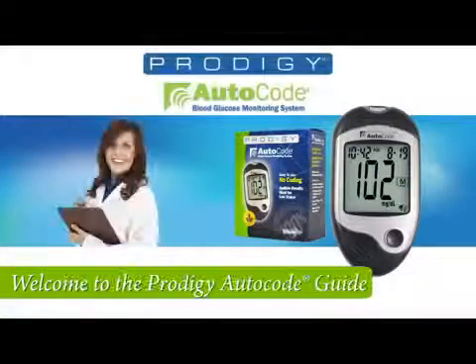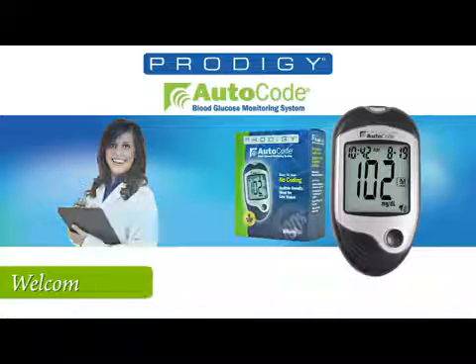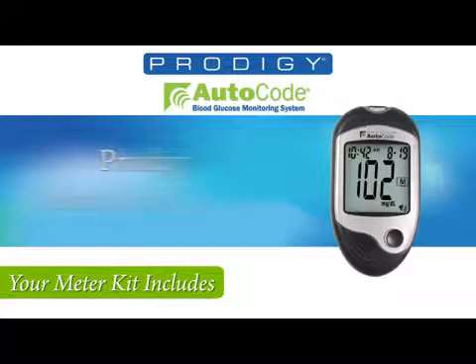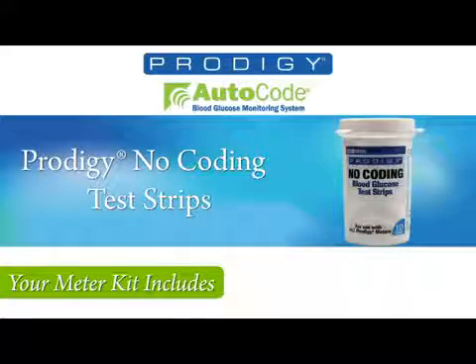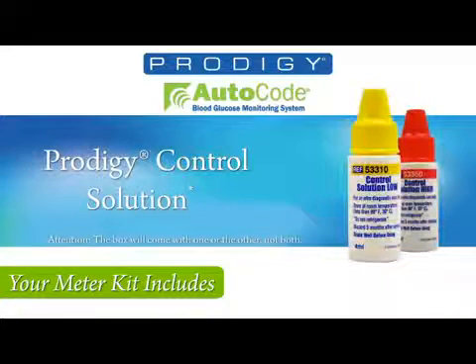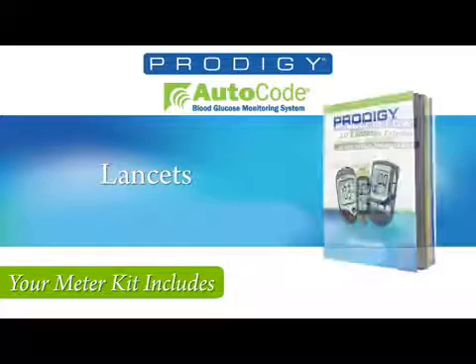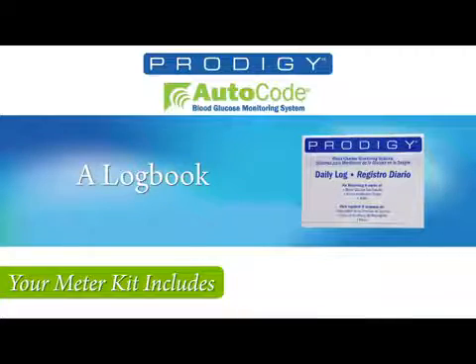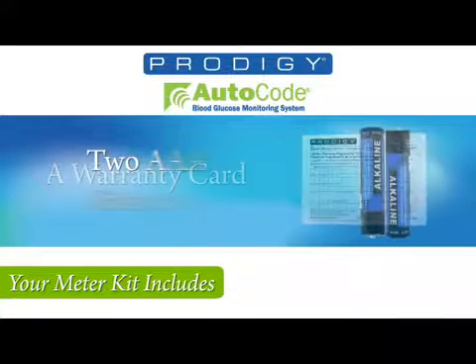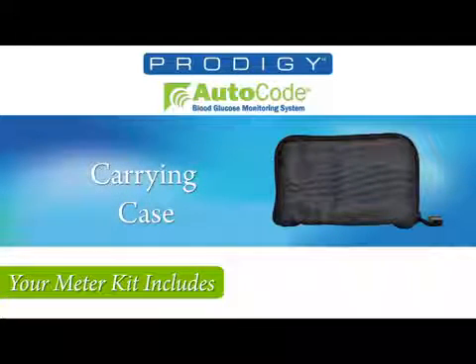Welcome to the Prodigy Auto Code Meter. Upon opening the box, you'll find inside the Prodigy Auto Code Meter, Prodigy No-Coding Test Strip, Prodigy Control Solution, a lancing device, lancets, printed owner's manual, logbook, warranty card, two AAA alkaline batteries, and a carrying case.